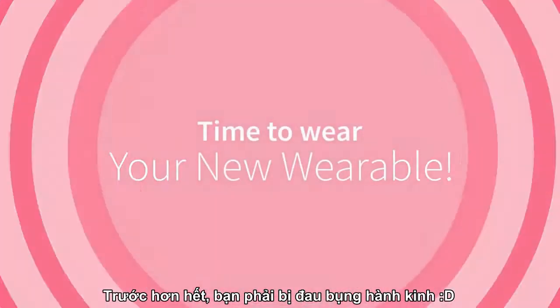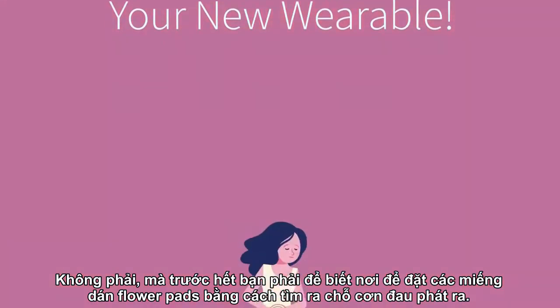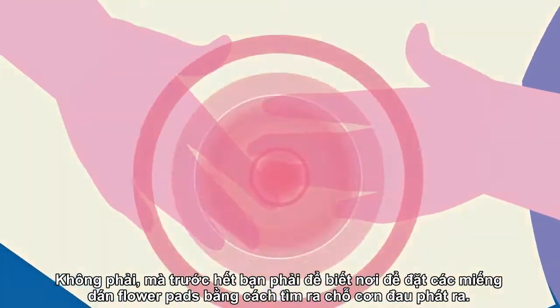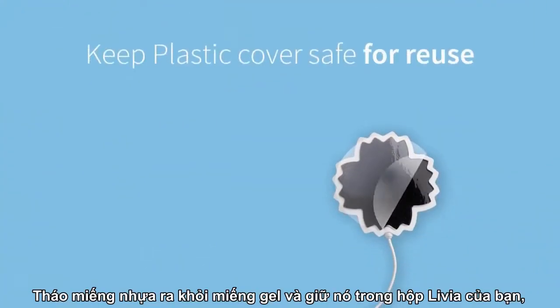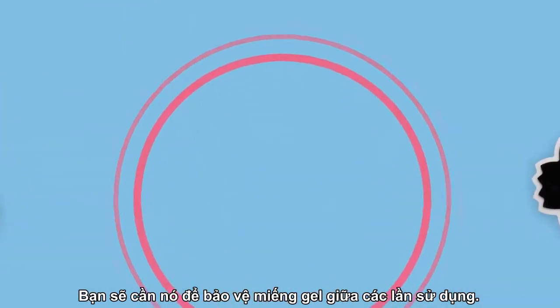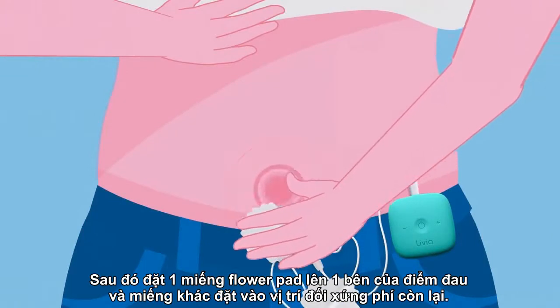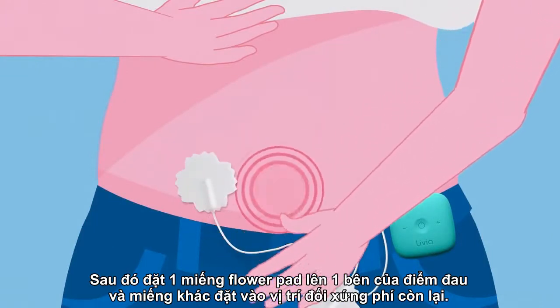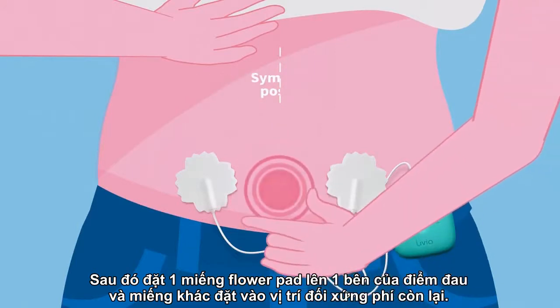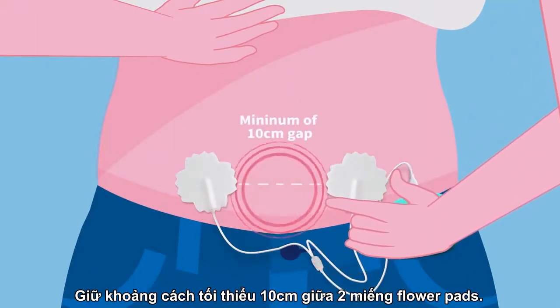First of all, you've got to have a period. To know where to place the flower pads, you need to spot where the pain comes from. Remove the plastic cover from the gel pads and keep it safe in your Livia case — you will need it to protect the gel pads between treatments. Then place one flower pad on one side of the pain spot, and the other pad symmetrically on the other side, keeping a minimum gap of 10 centimeters between them.